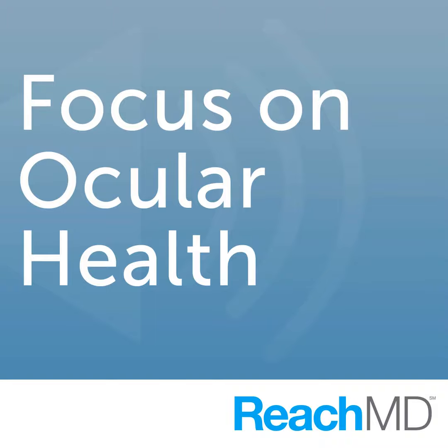Currently, the commercial units that are available claim to be at the order of about 5 microns. Now, 5 microns is a little bit smaller than a red blood cell. And while we can't actually see cellular details, partly because of the movement from just breathing and from the heart rate, we're able to appreciate very fine layers of the retina which would otherwise be invisible even to a very close examination with a contact lens at a slit lamp. So very, very subtle pathology that was otherwise unavailable to us is now part of our everyday armamentarium in terms of treating patients with a whole variety of visual complaints.